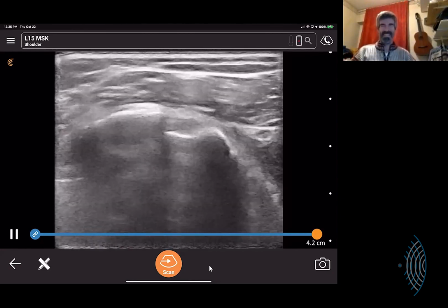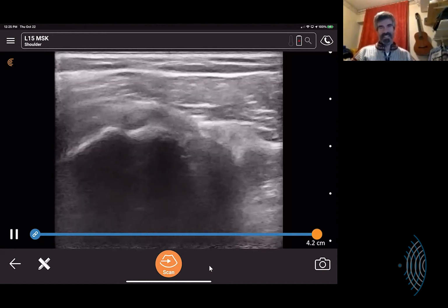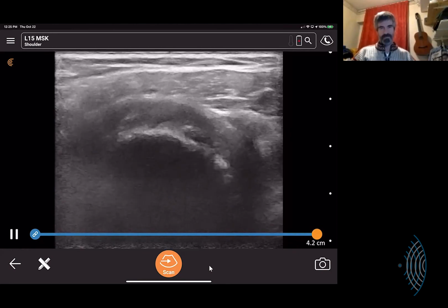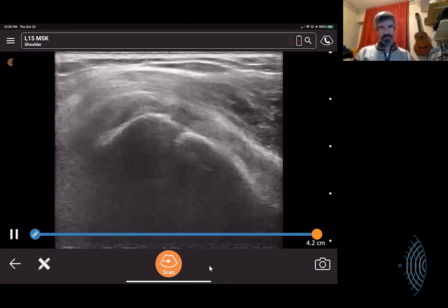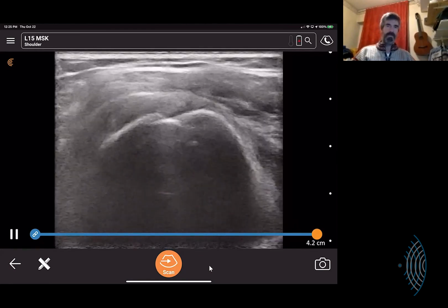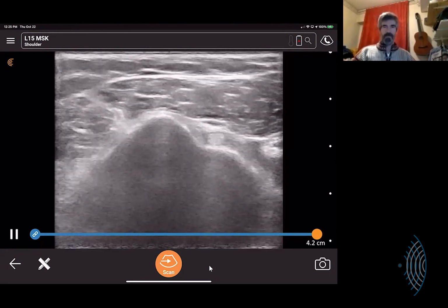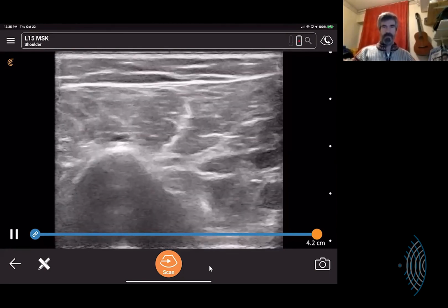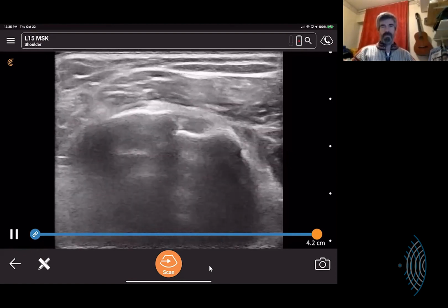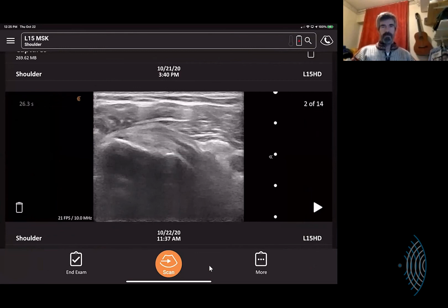But what I want you to realize is that this is in essence a loop that I start usually at the pec major insertion. I go right above it. I try to go up, catching it through the groove, and then as I go over the top of the humerus, I try to go a little bit more to an internal rotation, trying to get that slice thickness in line with the tendon. So what I'm going to do next is show you, hopefully, if I can go here. Are you seeing that? Oh, how come yours is not? Oh, there we go. You're a little behind me. Now we're long axis on the subscapularis insertion.